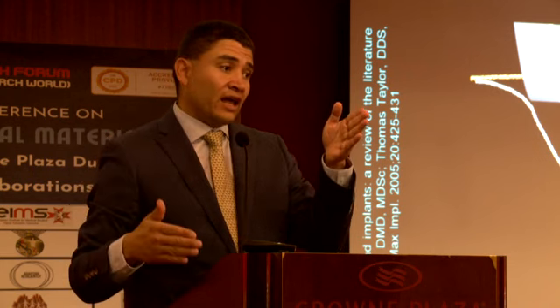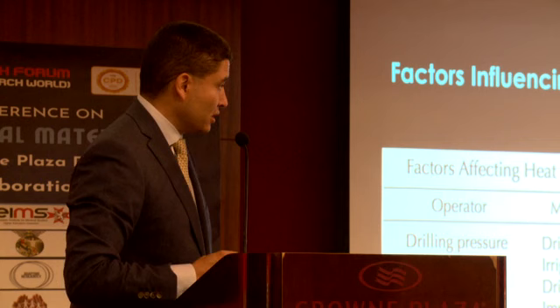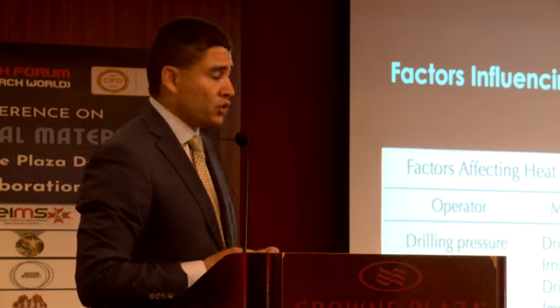So between 48 hours and 6 to 8 weeks, you don't load the implant. Because if you load the implant, you're going to lose the implant. Okay? It's very simple, right? And that has been shown by research and that was presented for the ITI consensus. However, there are other factors that influence the way we prepare the osteotomy.